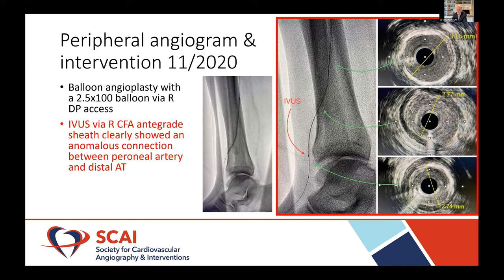The way the wire initially reacted on that anterograde cross, it didn't feel like a CTO — just felt different. And you can see calcification tracking over, which gave us a clue this may have been an anomaly — the way it transitions gradually, as opposed to what you see in collaterals, which is not so gradual. So we just gently ballooned it with a 2.5mm balloon to make some space for the IVUS, but didn't get aggressive with that balloon — just wanted to get some space. Definitely no substitute for experience and feel.